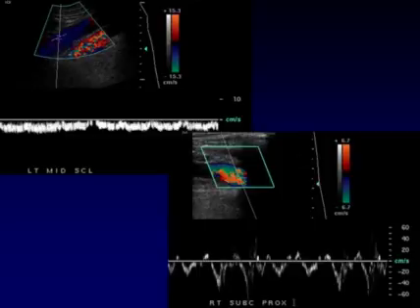But always very important to document, at least in the subclavian veins, a couple of images of the triphasicity of the normal vessel. If we do a unilateral study, as part of our protocol, I always insist that we also obtain some images from the opposite side because, again, the normal phasicity of the upper extremity veins is very, very variable from one person to the next, and it helps to have that image from the opposite side so that you can use that as a baseline for comparison with the other side. This, of course, may fall flat if you've got bilateral brachiocephalic or superior vena cava disease, but for the most part, I think it's a very important thing in the upper extremities to have that comparison of the spectral patterns.